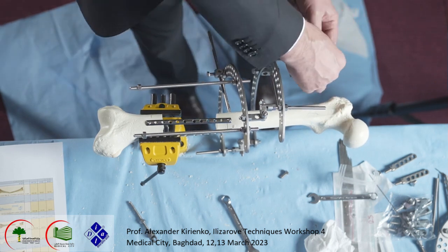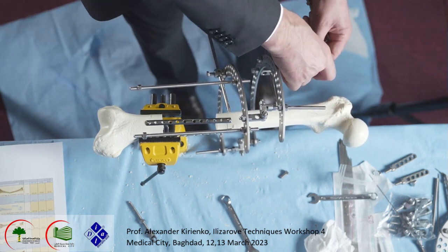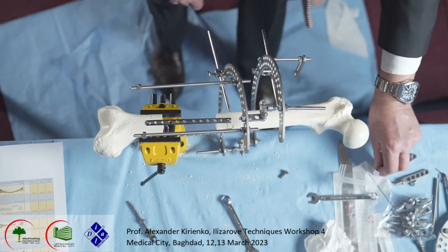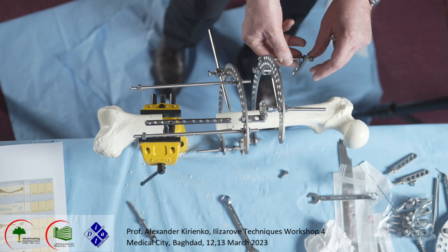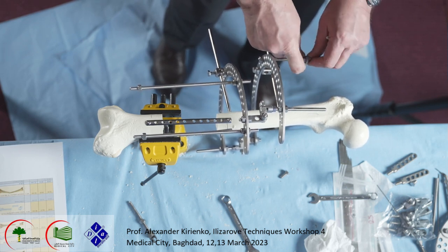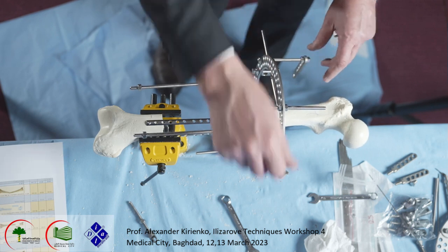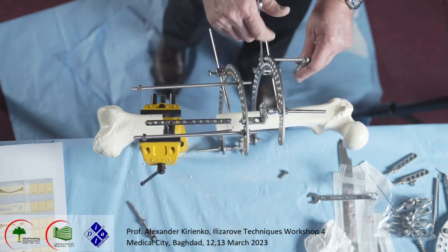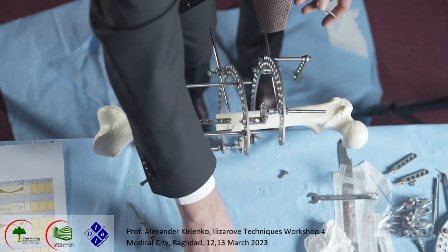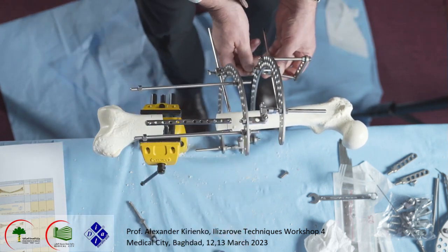And I put the plate here, and this way I extend my half ring, because it's the proximal part. Like I said before, I don't put the half wire, because in the Kurgan, traditionally they use only wire, and I used only wire, but now we use half pin in the proximal femur. And what I do is like this.